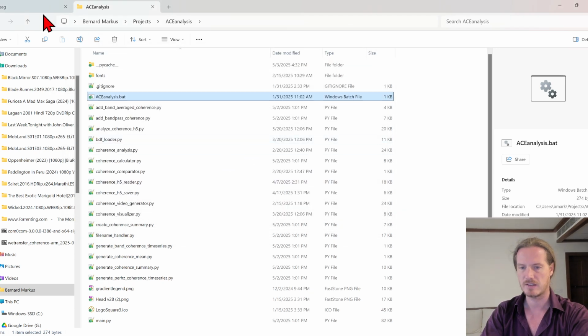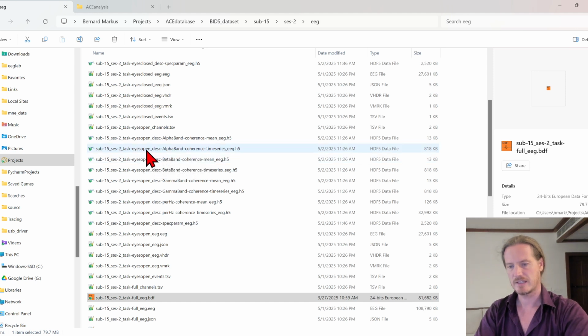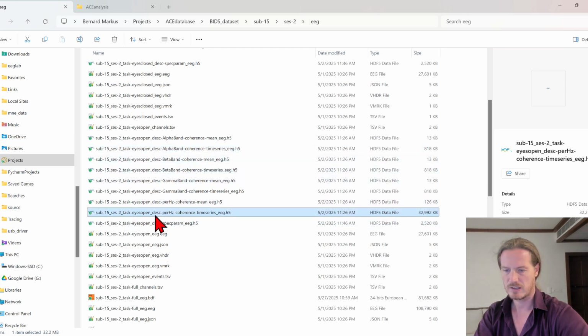And then now we're back in the database. We see subject 15, session 2, and here their task is eyes open, and we see all these files here. You can see they're labeled H5, and this is the alpha band coherence H5, and there's the time series of that. And we're going to take a look at this file here. This is for the eyes open task, and I call this the per hertz coherence time series. So what does that mean? Let's take a look.